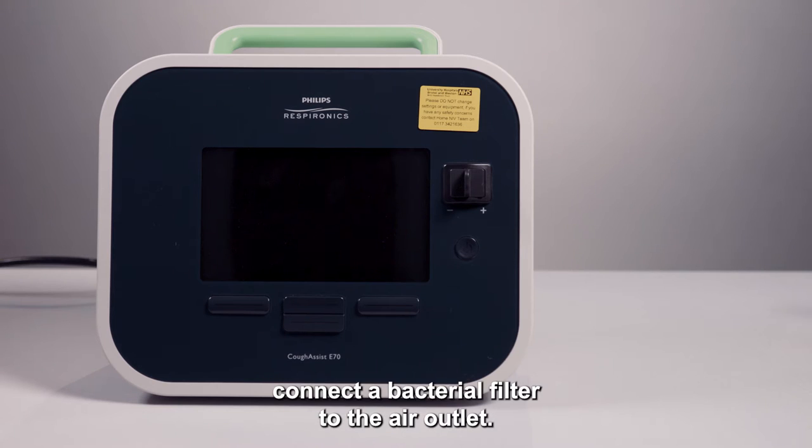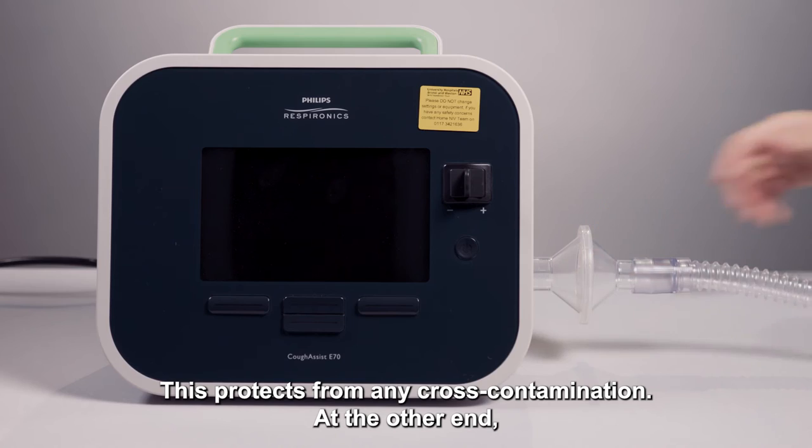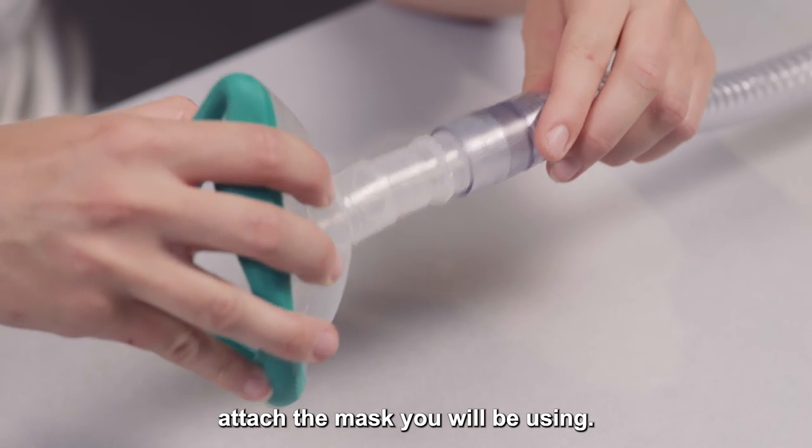To set the device up, connect a bacterial filter to the air outlet. This protects from any cross contamination. At the other end, attach the mask you will be using.